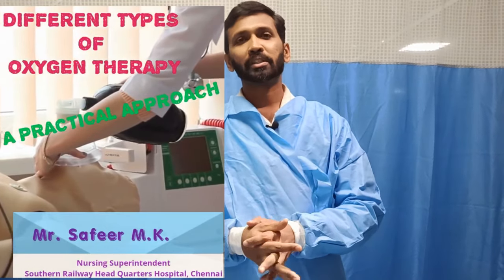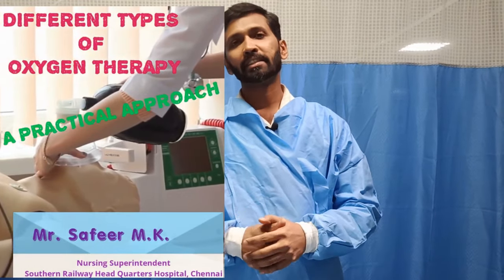Today we will discuss the different oxygen delivery devices used in our hospital. Okay, so the oxygen delivery devices are basically of two types: low flow oxygen delivery devices and high flow oxygen delivery devices. We will discuss both low flow and high flow in detail.